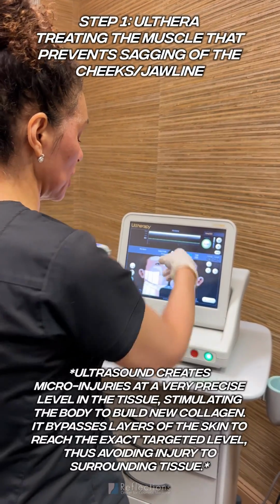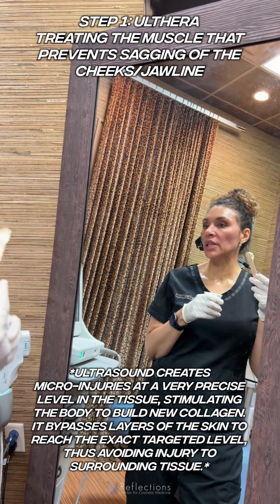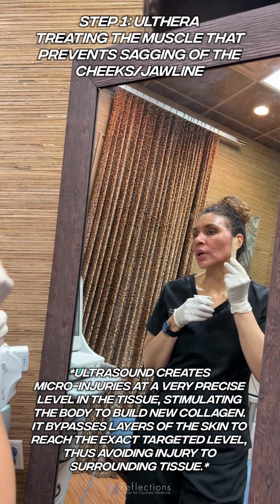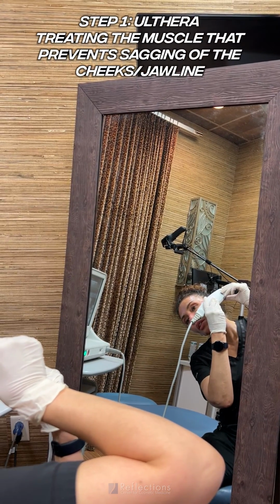Here you can see this is the ultrasound image. It can show you where the level of the muscle is. In order for ultrasound to work, you have to have ultrasound gel. So you're going to apply it in the area where you're going to treat. And it feels like tiny little bee stings.